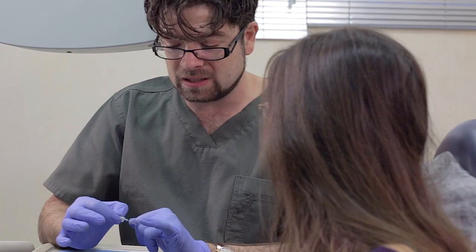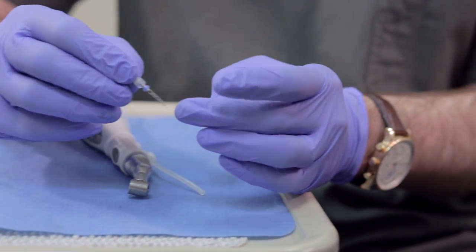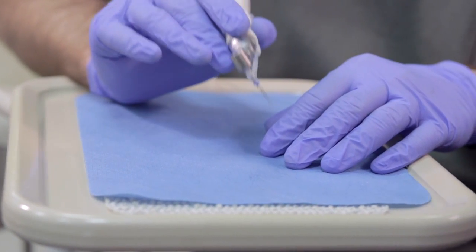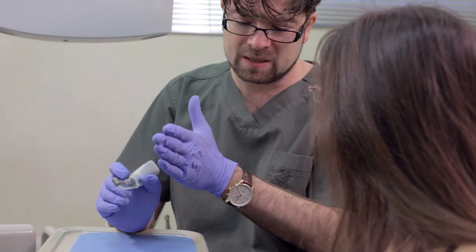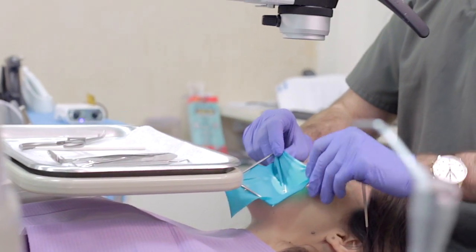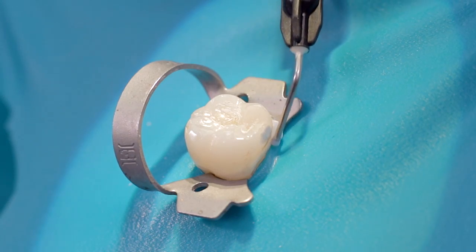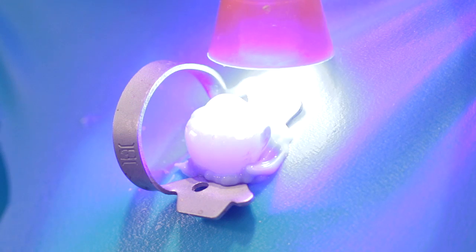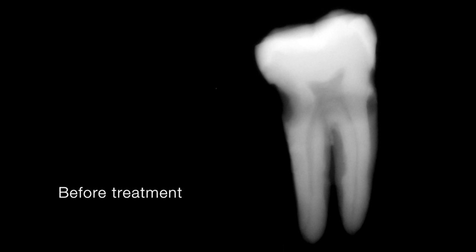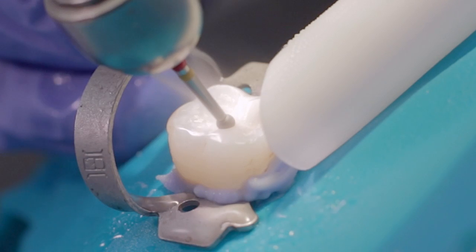The SAF mode of operation is unique and can neither be classified as step back nor crowned down. This single file shapes, cleans, and disinfects the entire length of the root canal simultaneously. To get used to this concept, adopt the system gradually into your clinical routine. Start from simple, more accessible teeth with straight canals, then move to molars. Isolate the tooth using a rubber dam.